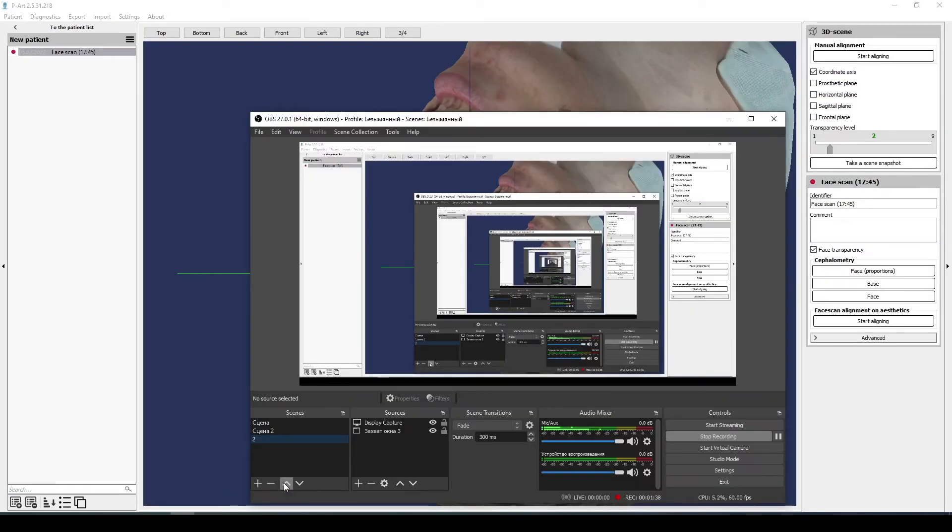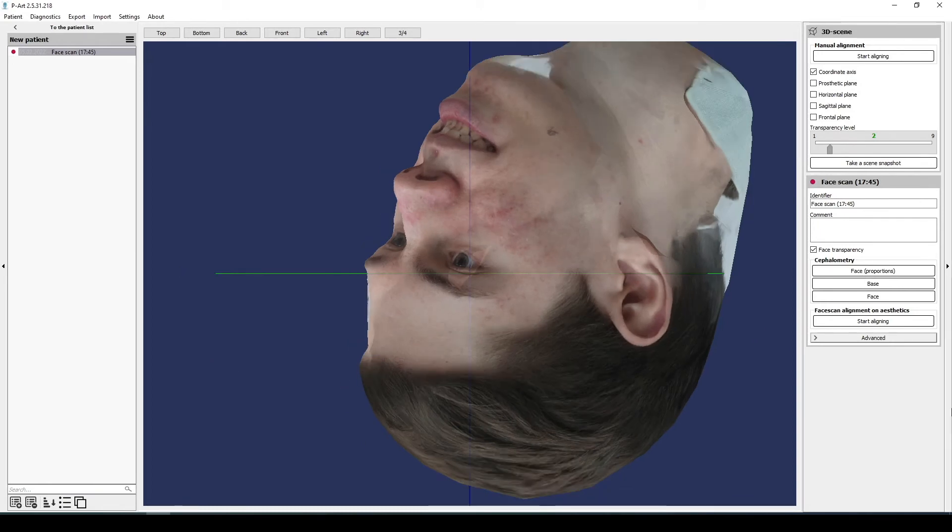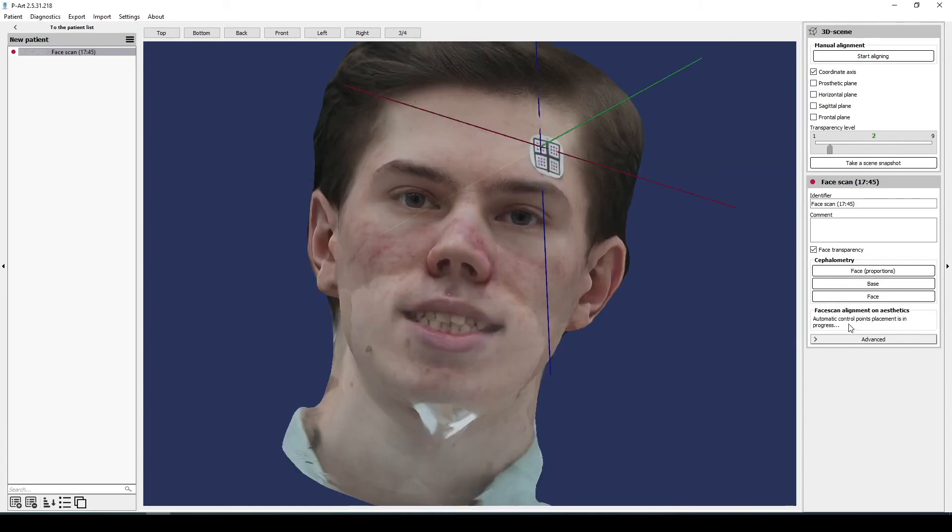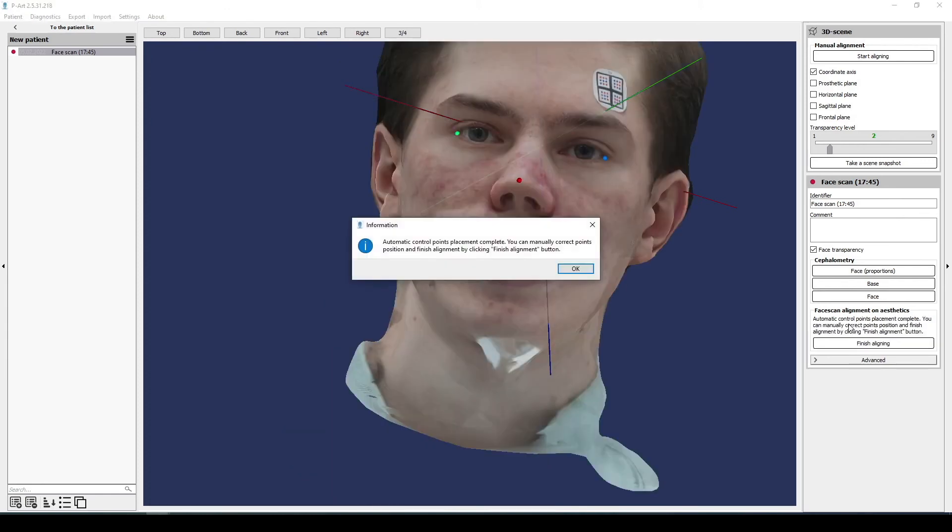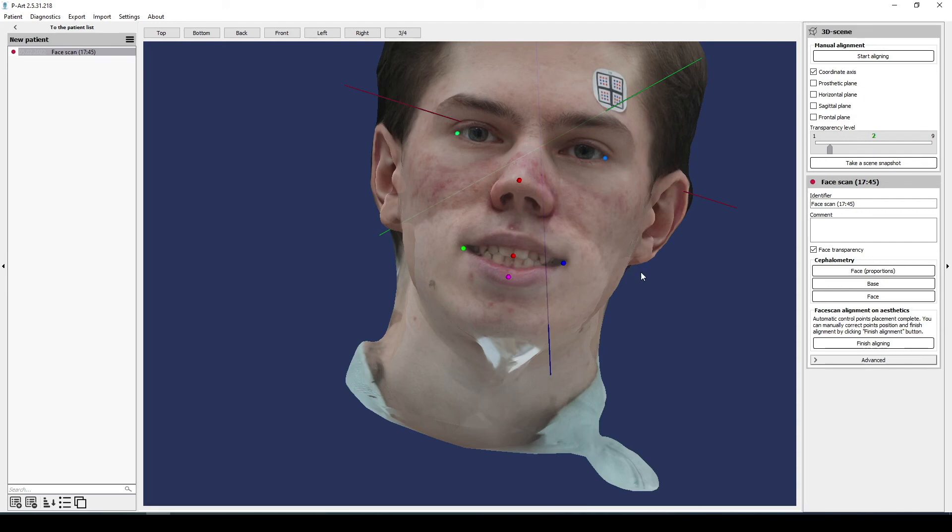After that you need to align the face scan for further work. To align the face scan in the right menu at face scan section we start alignment. The program will automatically place all the necessary alignment points. They are aesthetics points. The points will be located in the lips area, in the area of the eyes and the nose, if these points need to be corrected or the program didn't completely place all the points.